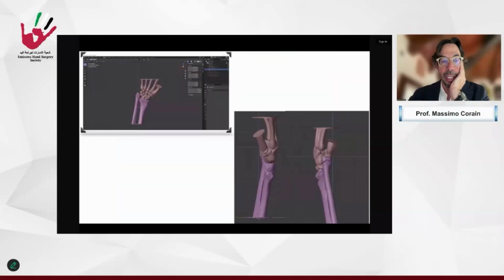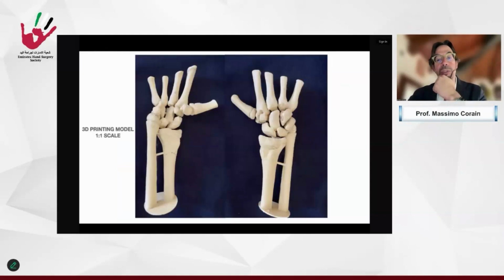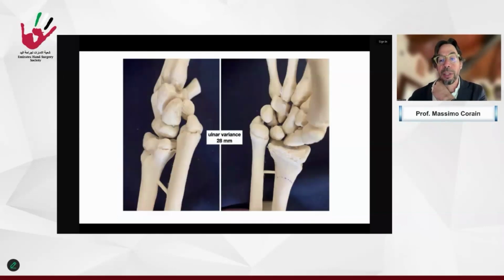So this is the digital CT that shows us the deformity, and I asked for a 3D printing model to consider in the best way the deformity, the remaining growth plate, and the distance for the osteotomy from the growth plate, considering the plate that I can use in this case. So you see with this 3D printing how clear and how wide is the reconstruction of the bone.